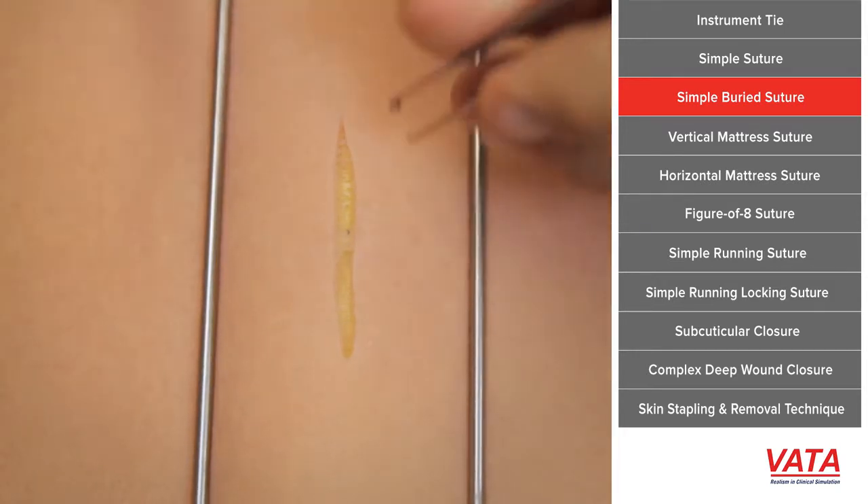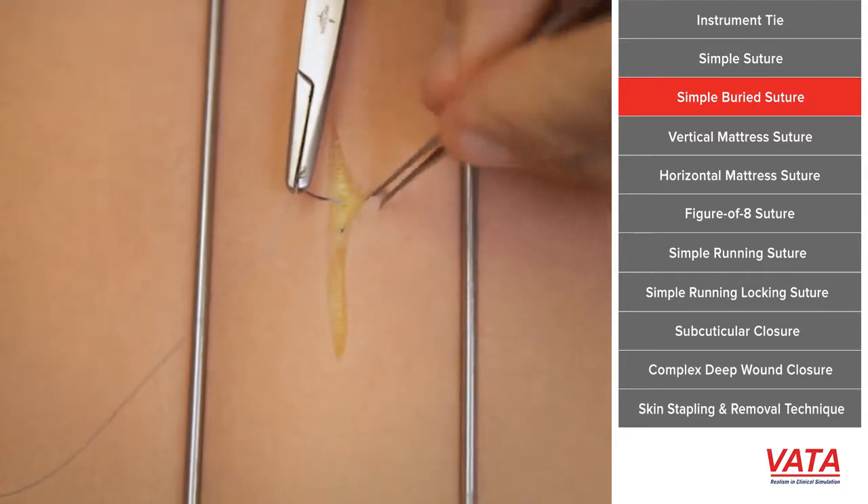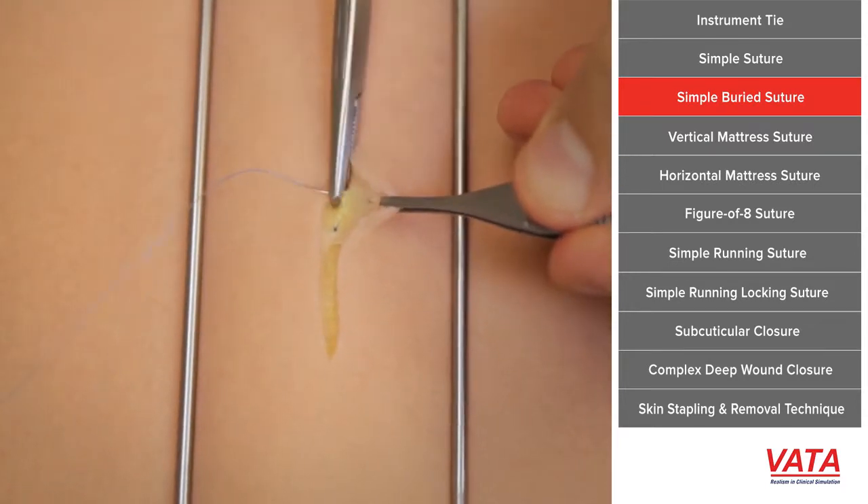whether we're just closing it with another suture. We don't want these little ends of the suture to poke up through the skin — we call that spitting.